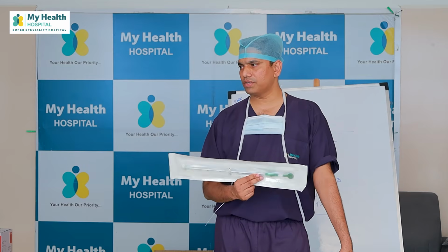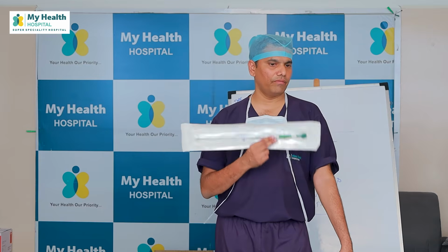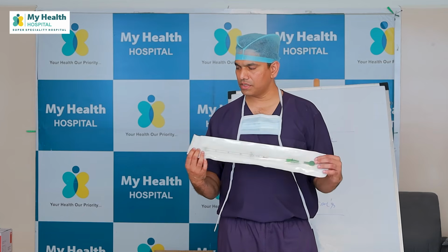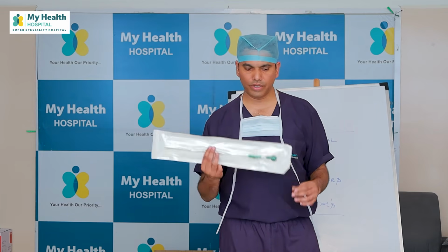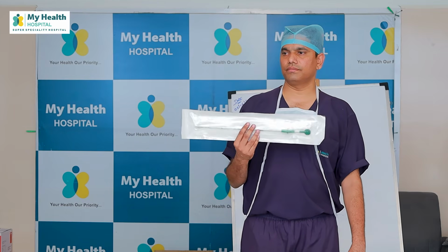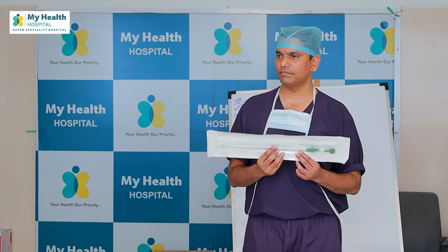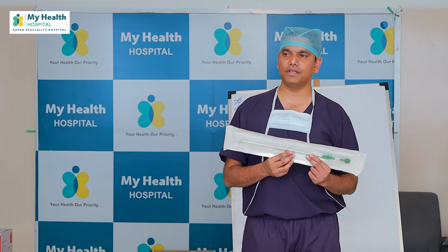This is easy to administer and easy to insert in a patient who has lung injury, emphysema, hemothorax, pneumothorax, hydrothorax, whatever it is. With trocar, we just push it in, it goes in. Can we use this for drain, Arun? Abdominal drains? Why? We can cut it. If we don't have an abdominal drain, this can be used as an abdominal drain. Can we use abdominal drain for ICDs? Why?